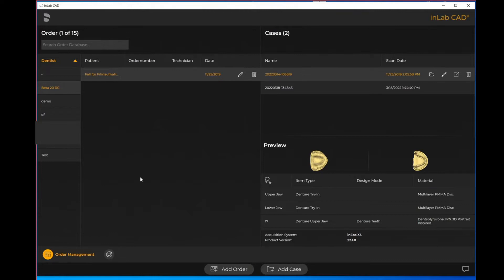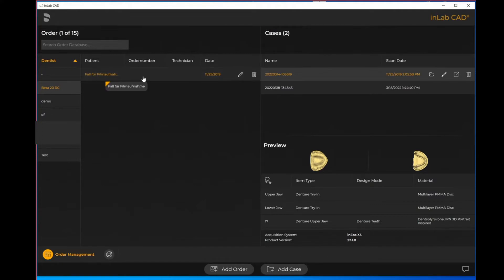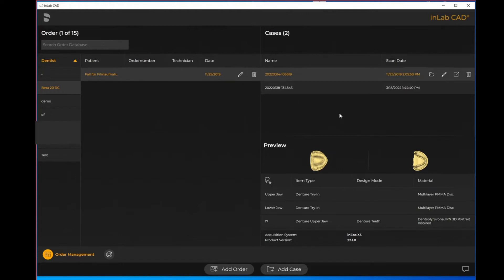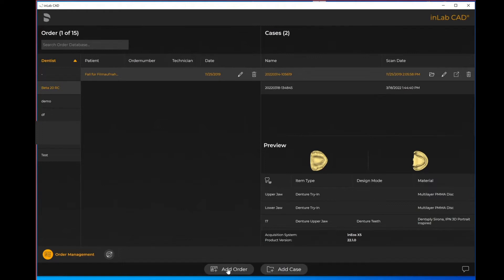Here in order management you'll see add new order or add new case. The main difference between the two is for add case, if you have a patient currently highlighted, add case will add a patient file to their existing cases. If I wanted to add a brand new patient altogether I can hit add order on the bottom here and it will take me to the following screen.